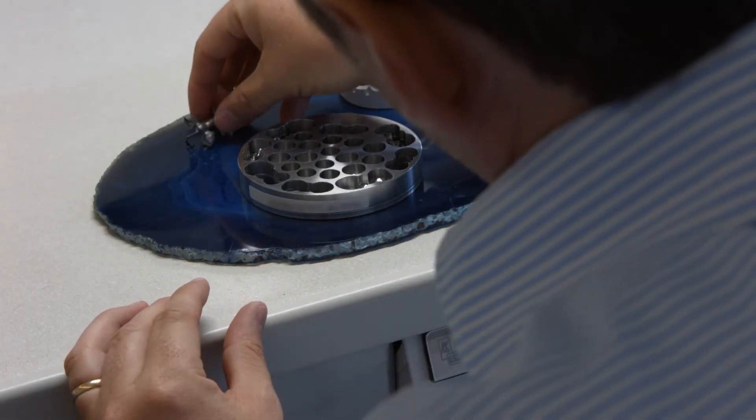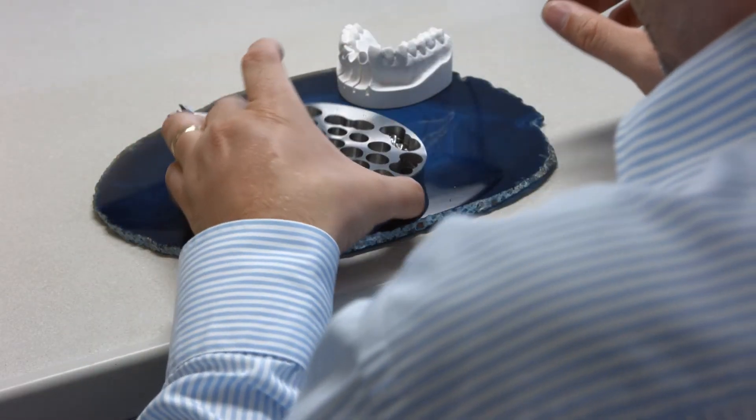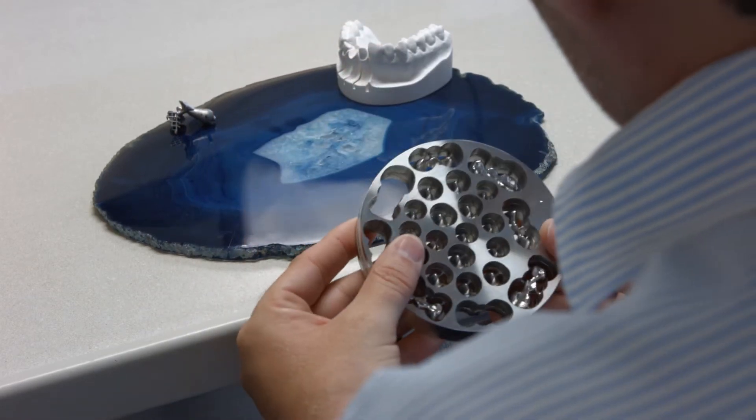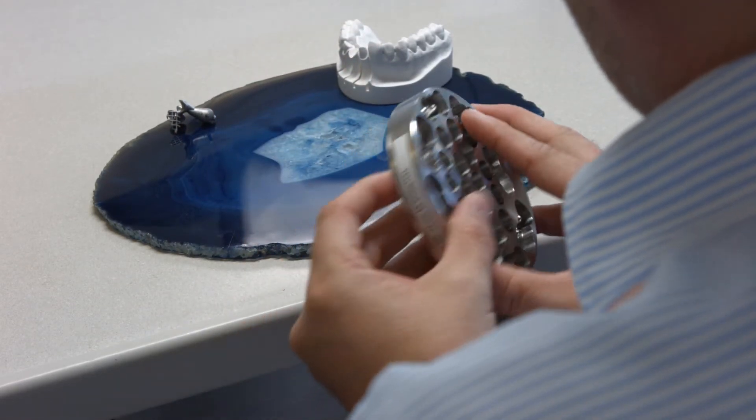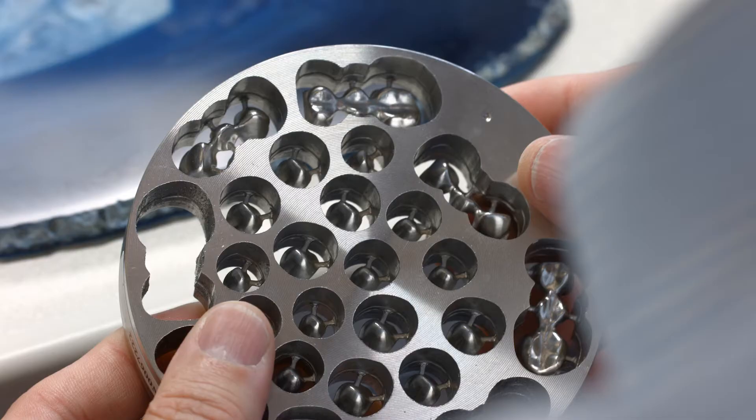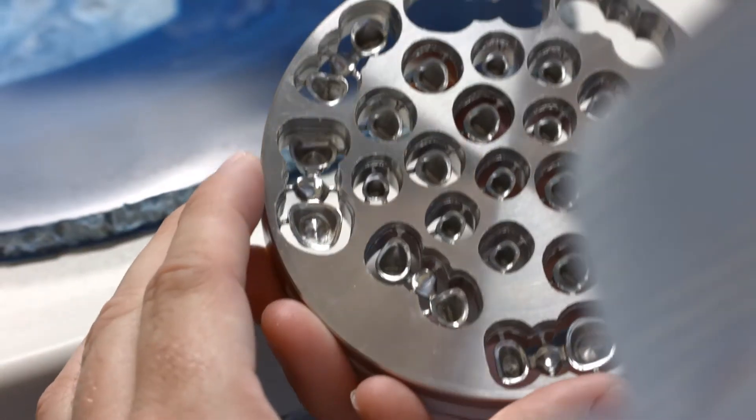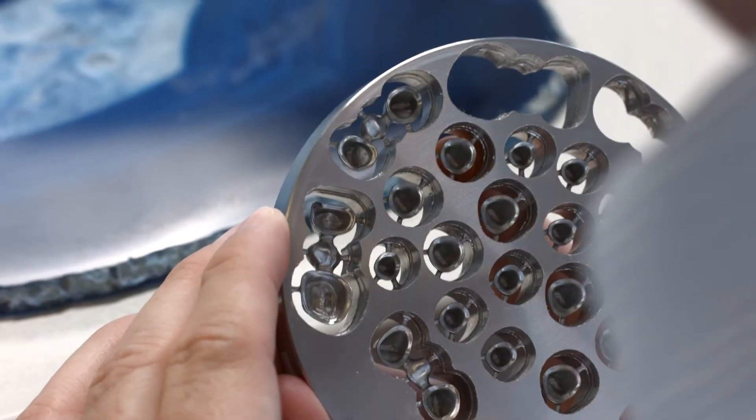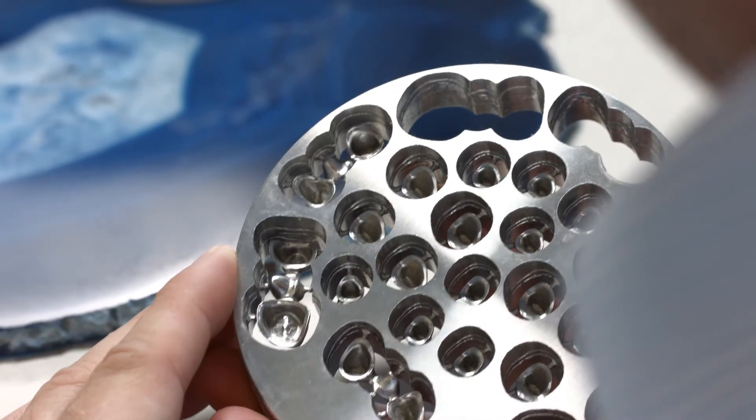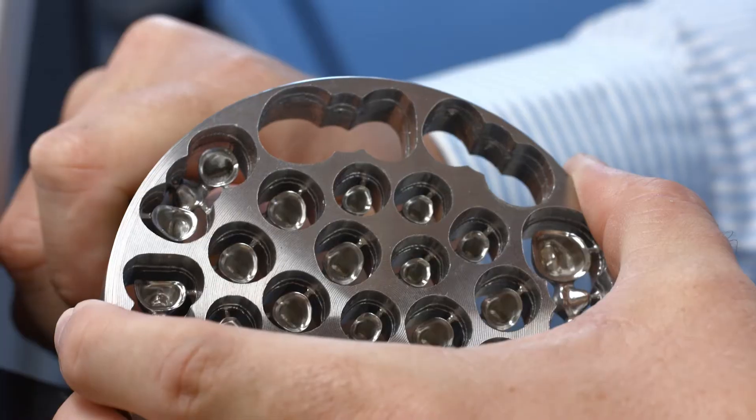Now you can start fabricating your metal framework according to the method of your choice. Follow the planned layering scheme and make sure that the framework has adequate dimensional stability. Avoid sharp edges and transitions. Bear in mind that insufficiently dimensioned metal frameworks will result in increased shrinkage of the veneering ceramic.